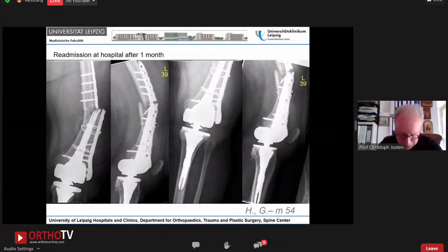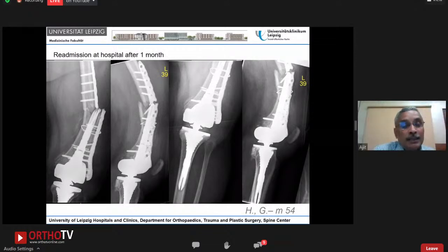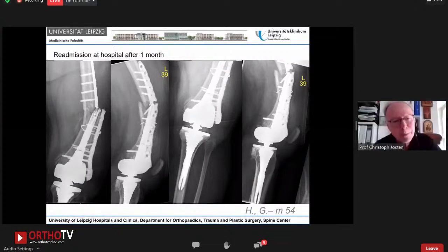Yeah, this is an interesting opinion, but sorry, to remove this stem is going to be a huge challenge. Then you can make a distal femur replacement. Then you can throw away all this here. It would be an option, I agree with you, if this patient would be 30 years older. In which case, I think keep that, put a new long plate, where you will not have screws at the fracture site. You will have some sort of elasticity and allow it to heal. Yes. Okay. Another option, another opinion.